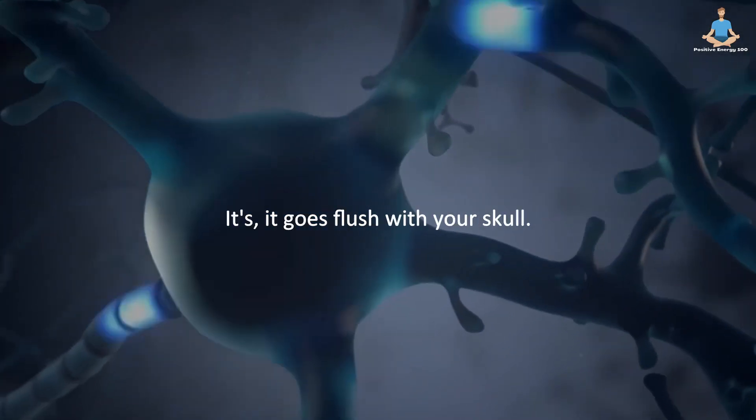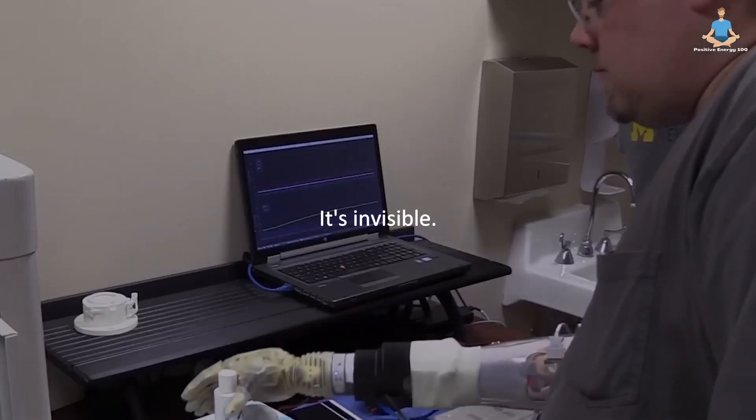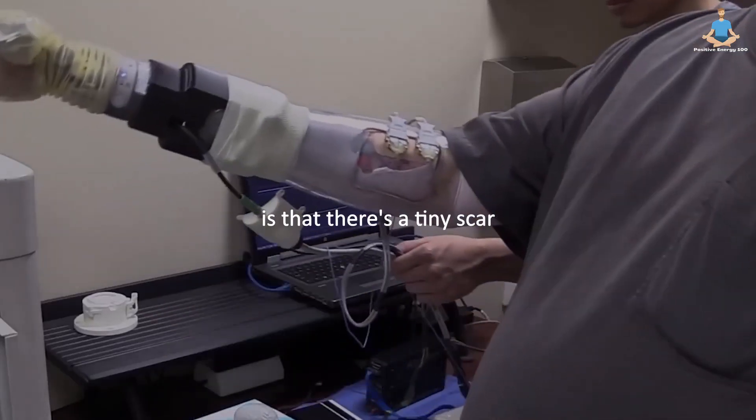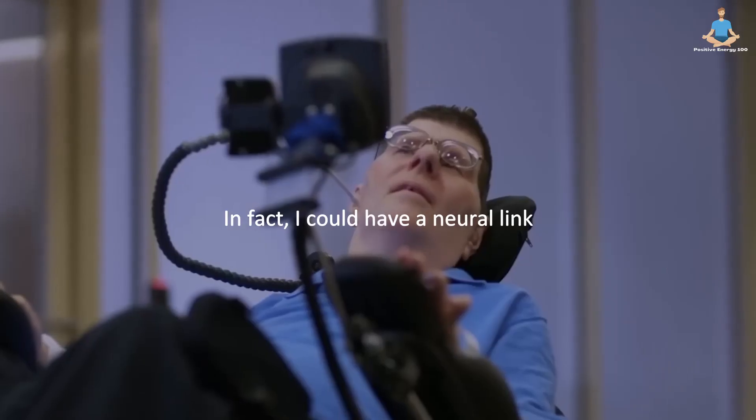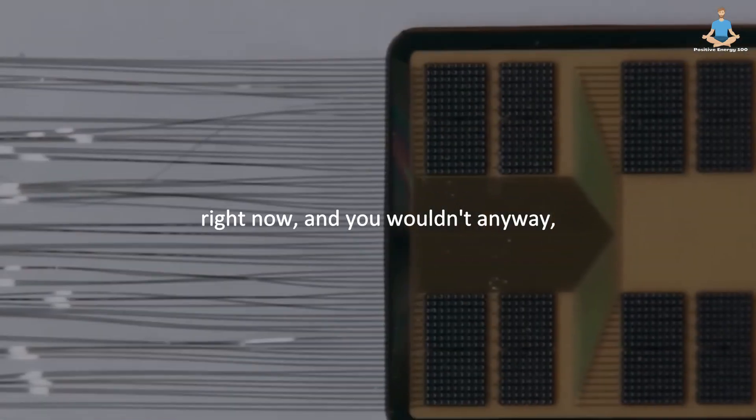So it fits, it goes flush with your skull. It's invisible. And all you can see afterwards is this tiny scar. And if it's under your hair, you can't see it at all. In fact, I could have a Neuralink right now and you wouldn't know.